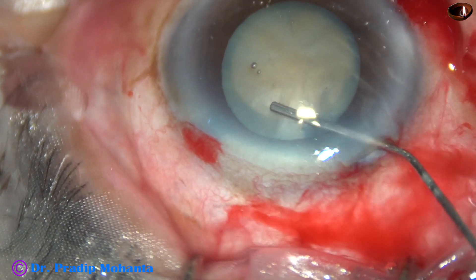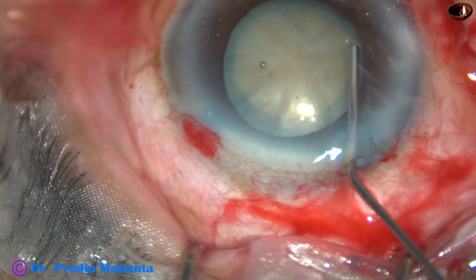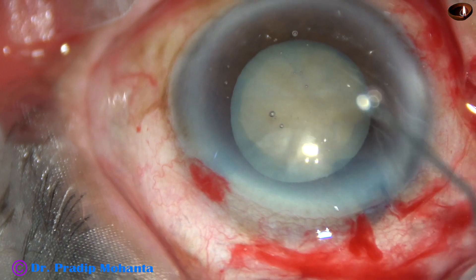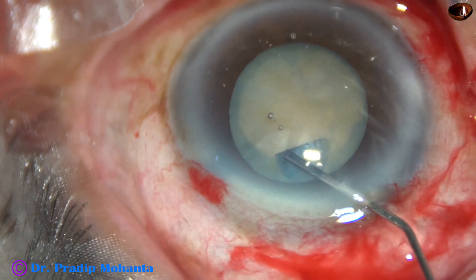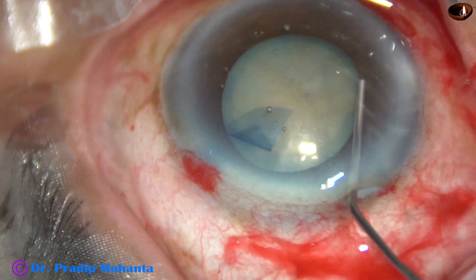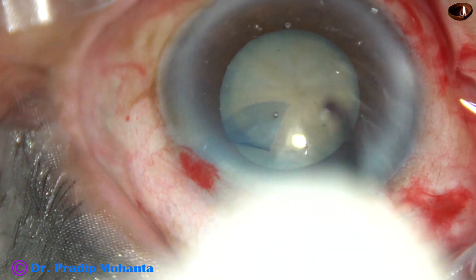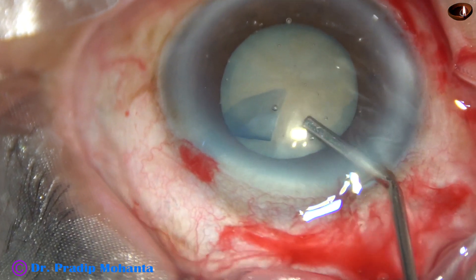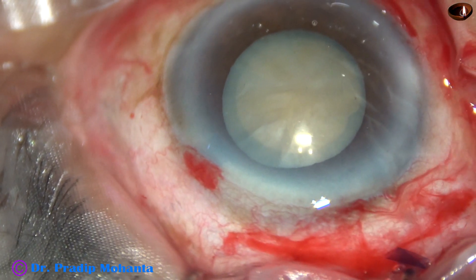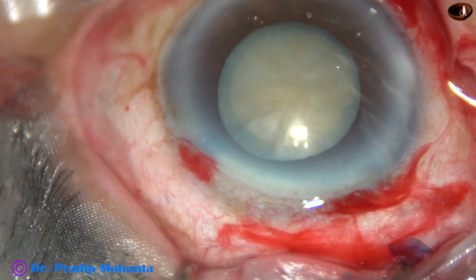This is hydrodissection. Fluid wave is being passed underneath the anterior capsular rim. And now this is a bit of adrenaline — I want to see if the pupil dilates a little more by application of adrenaline. Yes, it has dilated a little more, and this will help me in chopping and emulsification of the nuclear mass.